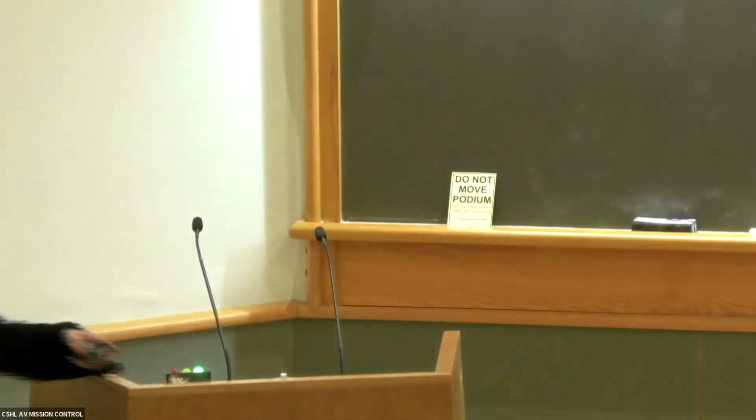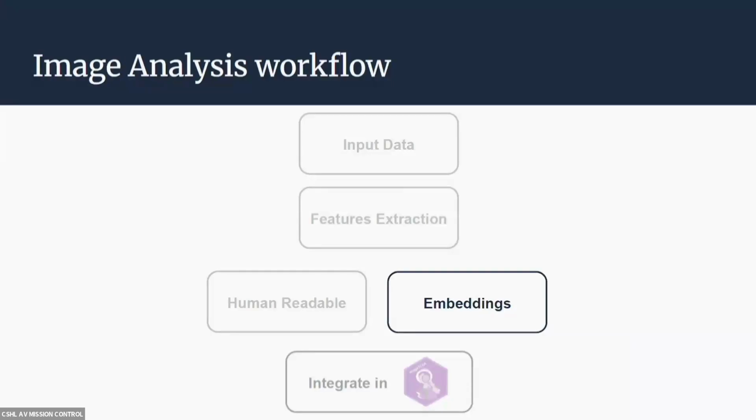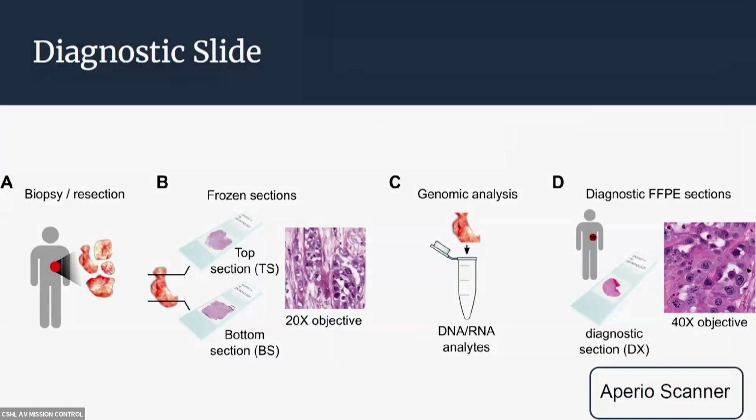I can show you here. Okay, that was quite far. Here in this D section, there are the 40X, which are the ones that we use, but the 20X are also available in the B section. There are a lot, but the quality is not so high. So for now we decided to just focus on the ones in which the quality is higher, because when the quality is not high, you don't get good results.